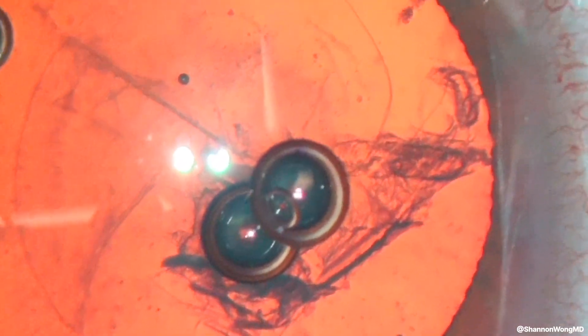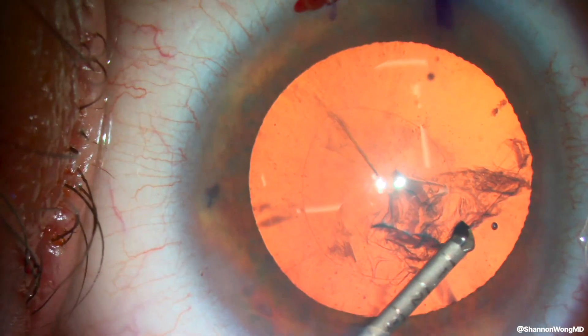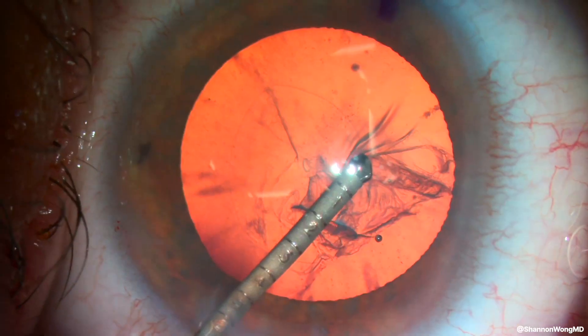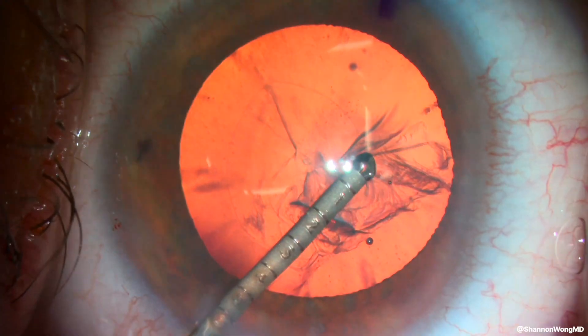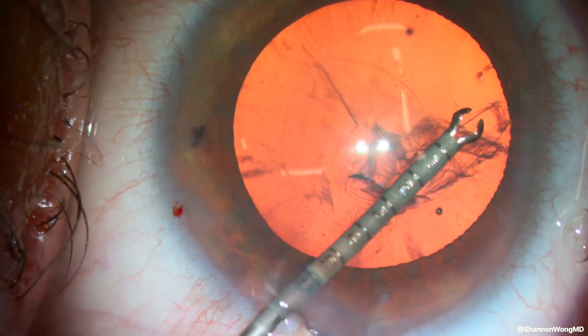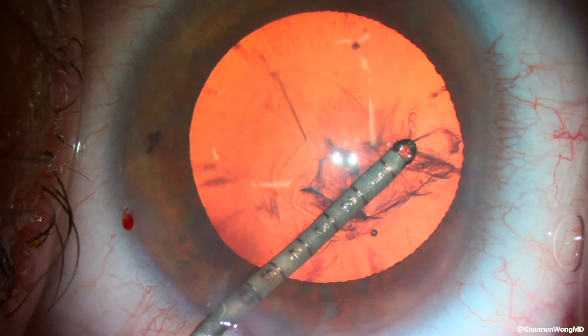We need to determine the extent of the tear in the anterior capsule. Did it extend to the zonules? Will I be able to rescue the anterior capsule tear or extension? So I call on our 23-gauge capsular forceps and attempt to perform the little maneuver when I pull on the anterior capsule flap to turn the capsular axis away from the zonules.